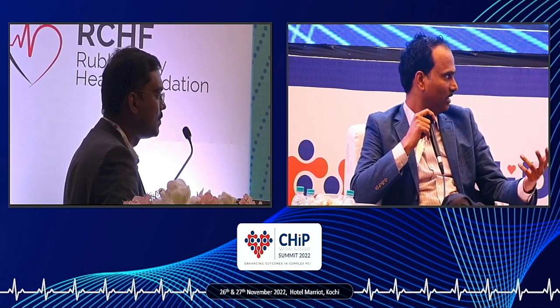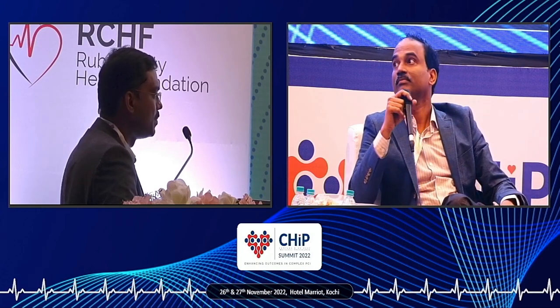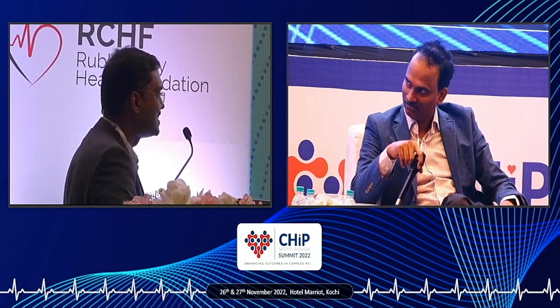Probably I would use laser as the first tool. Persistent calcium should be mild to moderate. If it is severe, obviously not.